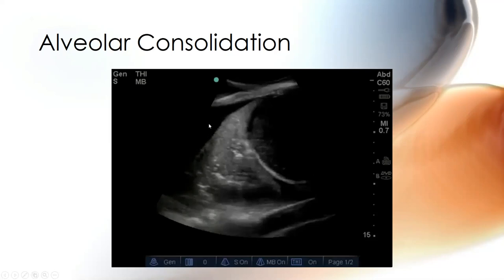Now, different situation. Patient comes in, 20 years old, car accident. Different story. This person could have a hemothorax and a hemoperitoneum, and this person needs to go to the OR. So depending on the clinical scenario, yep, it's absolutely blood. This person needs a chest tube and they need to go to the OR. This is a positive FAST exam. If you ever hear them in the trauma bay, FAST exams were only initially designed to detect blood in the belly. But now we can detect blood anywhere. So now the pickle is the cirrhotic person who comes in and wrecked his car. It could just be that he has ascites. So take that with a grain of salt, but our patients don't read textbooks.